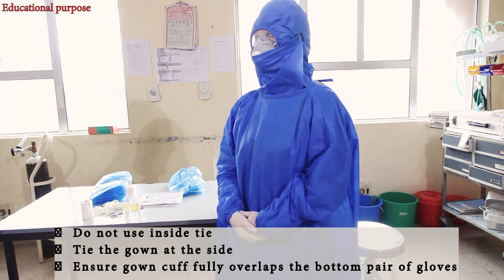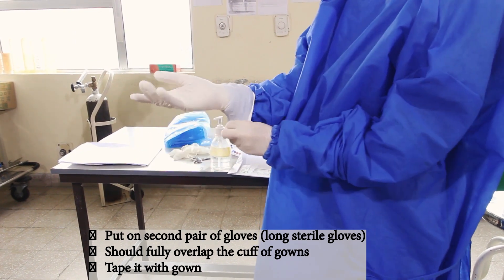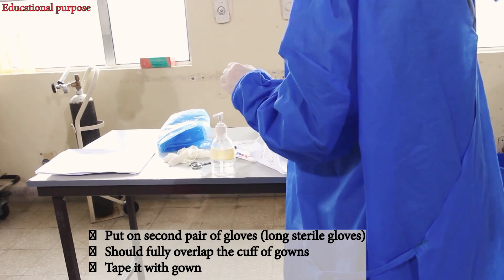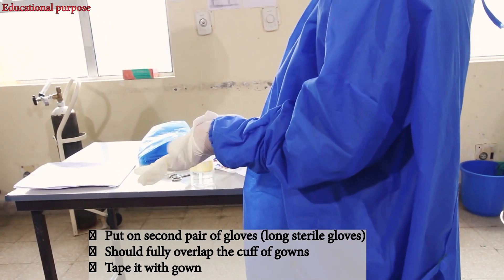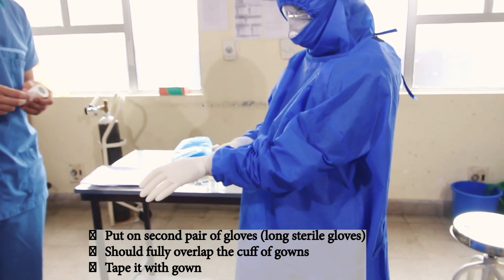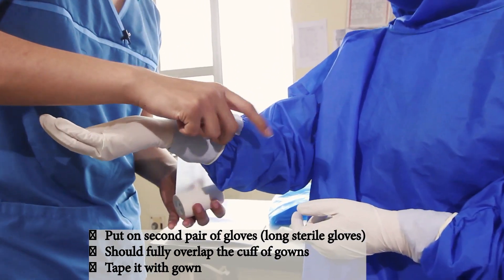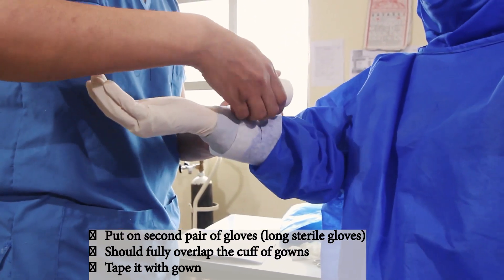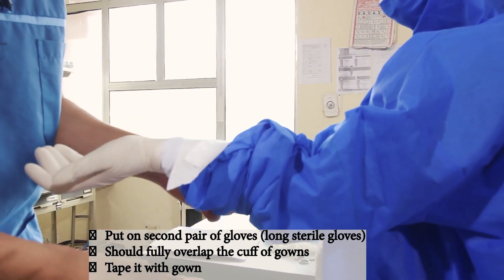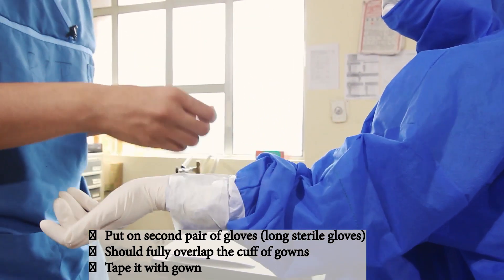Make sure that the gown is tight at the sides too. Now put on the second pair of gloves — the long sterile ones. We need to ensure that this glove is taped to the gown as well, so that when we remove it, it comes out as a unit.